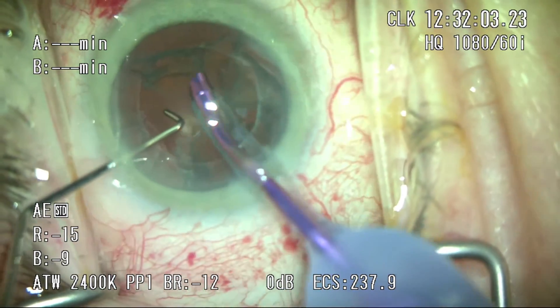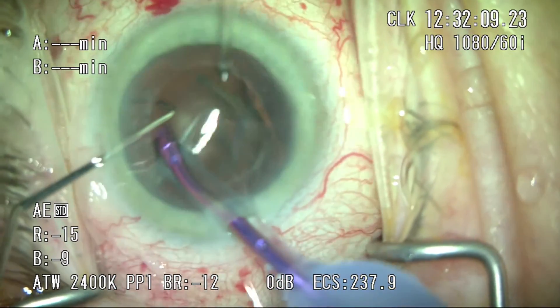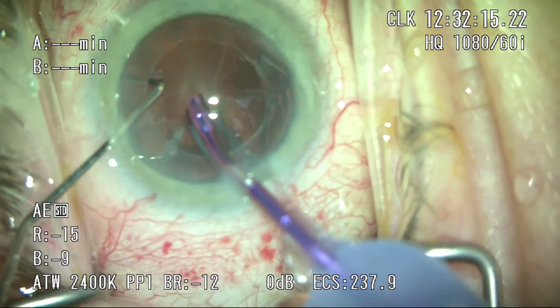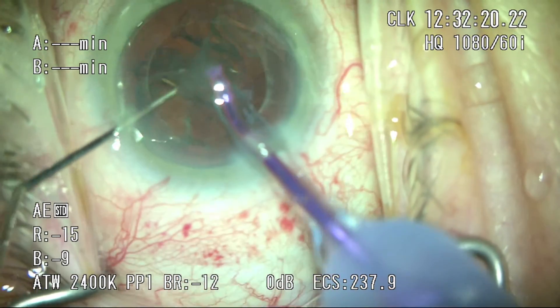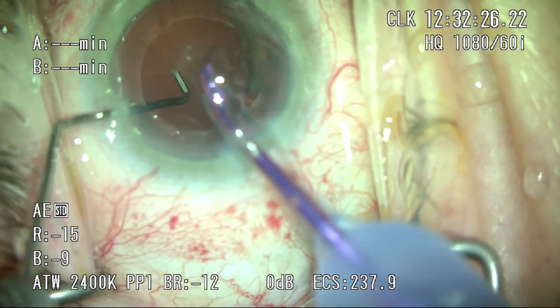The one thing we have changed is the safety margin between the posterior capsule and the posterior limit of energy delivery, now set to 800 microns, and we haven't had an issue so far. A quick word on the microincisional cataract surgery platform: even with my chopper back as an extra safety measure, you can see incredible chamber stability — indicated by no billowing of the posterior capsule and complete stability of the iris as we go after the last pieces.